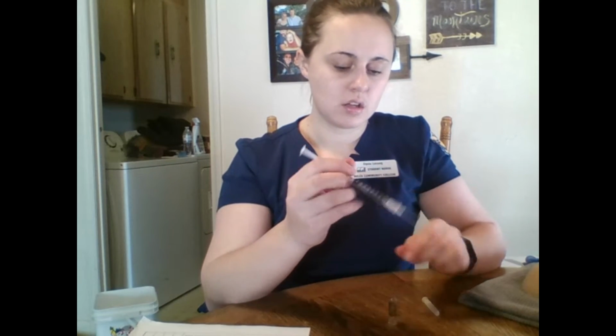All right, so now I'm going to pull the syringe back to 0.7, because we want to have 0.2 milliliters of air in the syringe. So I want it at 0.2. And I'm going to pull the medication back to 0.7 again, because I want the 0.2 mils of air.